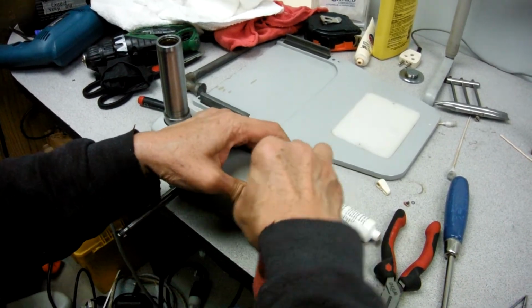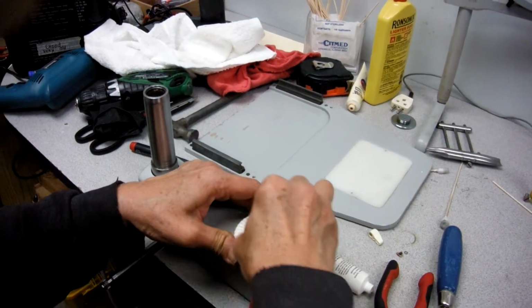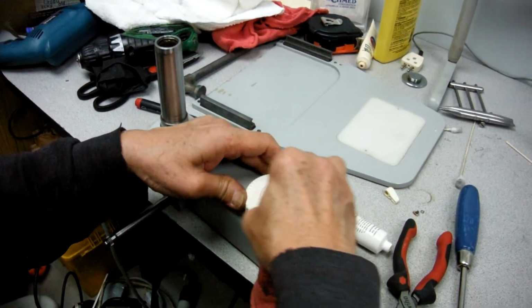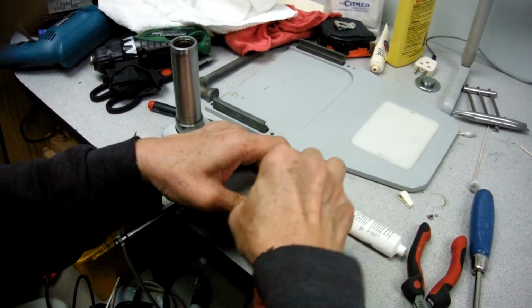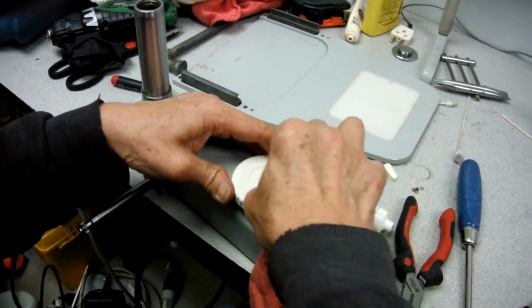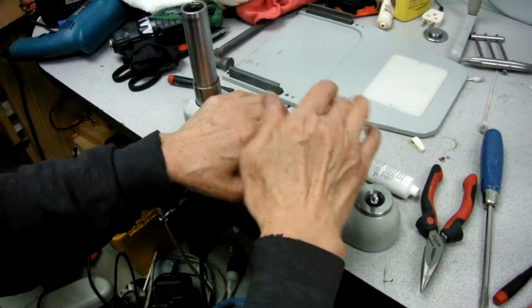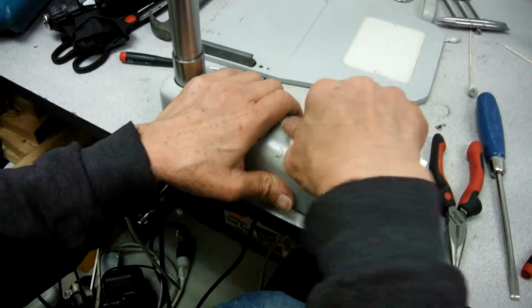And clean it again. Clean it with the lighter fluid, or you can use Windex or glass cleaner or anything. Fantastic. For the elevation, you can check it by rotating it up and down. It's smooth.